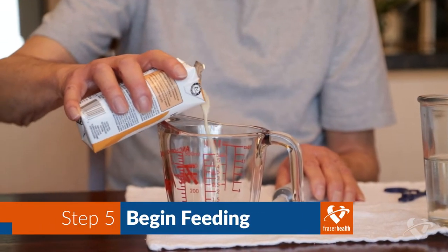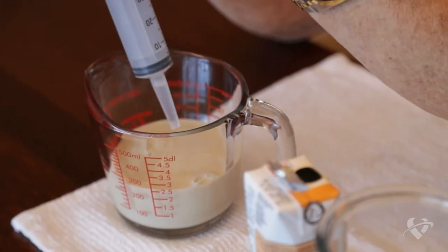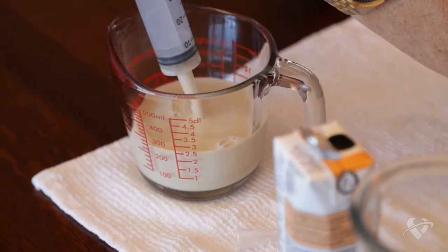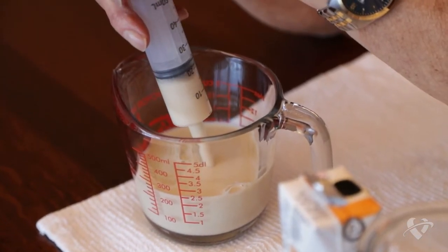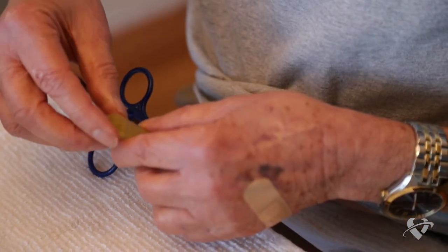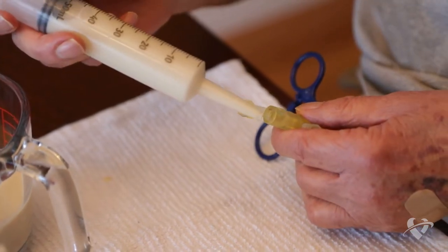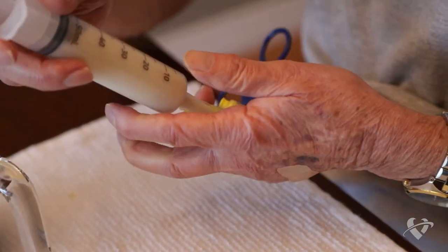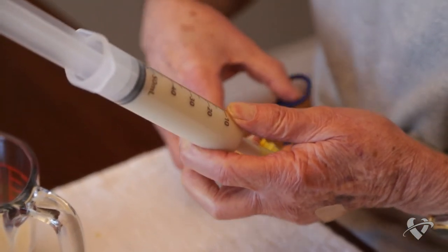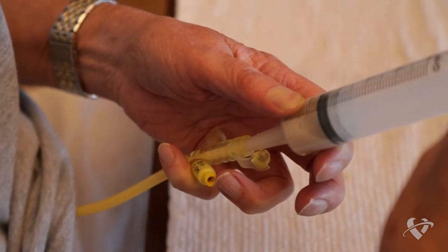Measure the recommended amount of formula into the measuring cup. Using the second syringe, draw up formula to fill the syringe. Clamp or pinch your g-tube before you remove the cap of your feeding port. Insert the tip of the filled syringe into the feeding port.